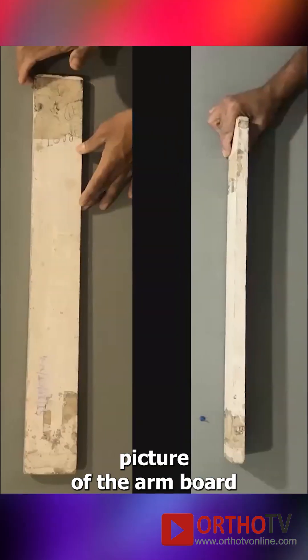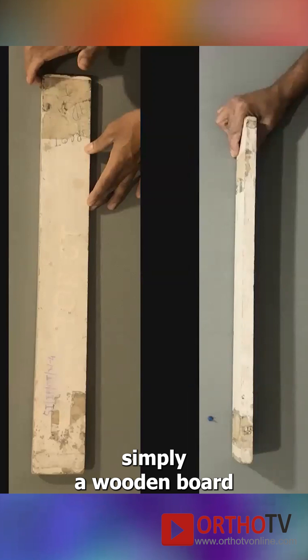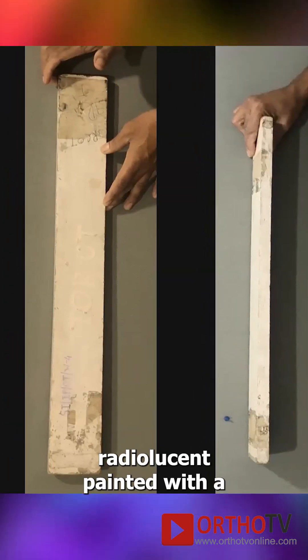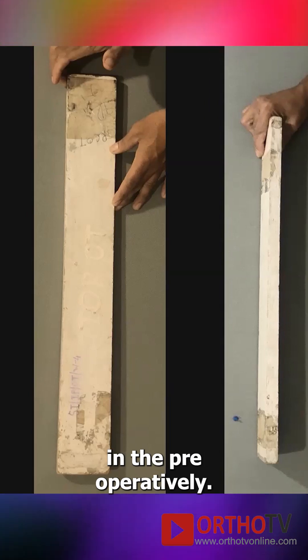This is the picture of the armboard. It's simply a wooden board of about one inch thickness, which is radiolucent, painted with a simple oil paint and is about four feet in length.